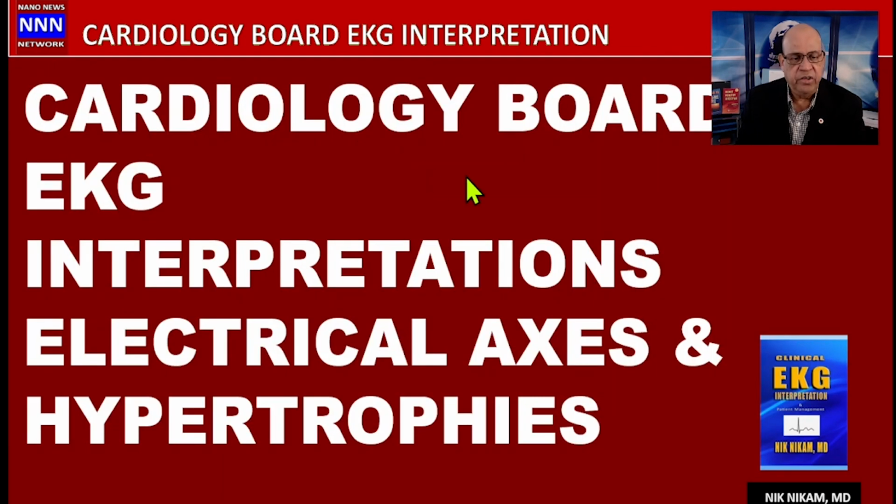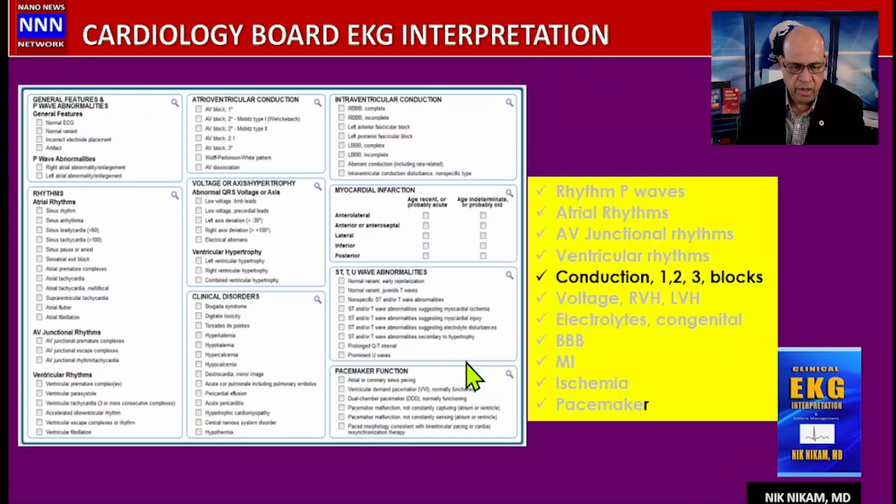The feature presentation is Cardiology Board EKG Interpretation: Electrical Axis and Hypertrophies. If you have taken a Cardiology Board prep course, you will be familiar with this answer key sheet that is used for interpreting the electrocardiograms in the EKG section of the cardiology medicine boards.